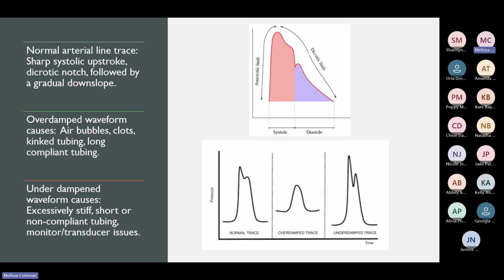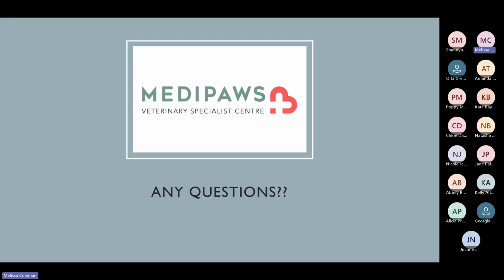And that is the end. So is there any other questions? The artery in the cat's tail, where is it? It's basically midline. So on the dorsal, if you've got them on their backs, just have their tail out straight, and you should just be able to feel it at midline, at the base of the tail.